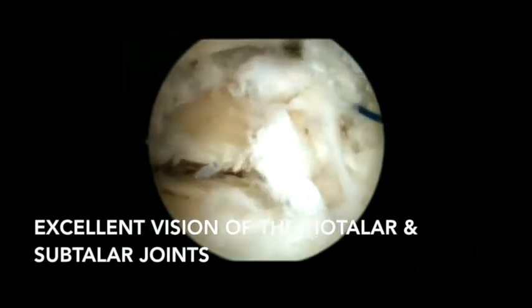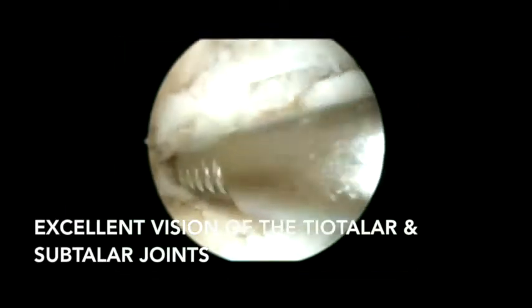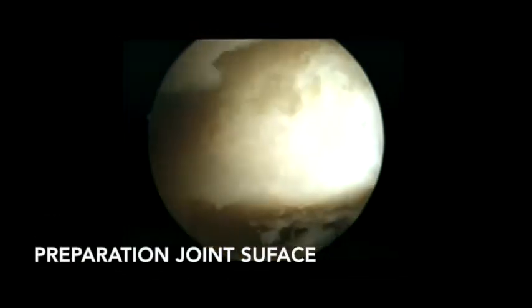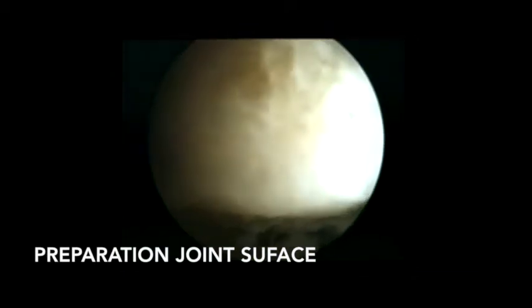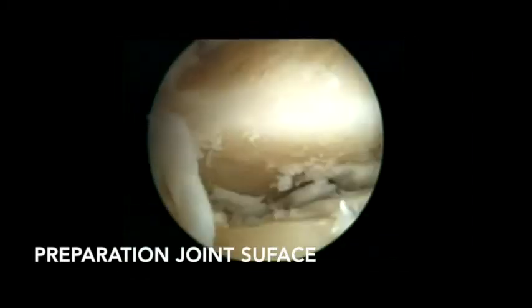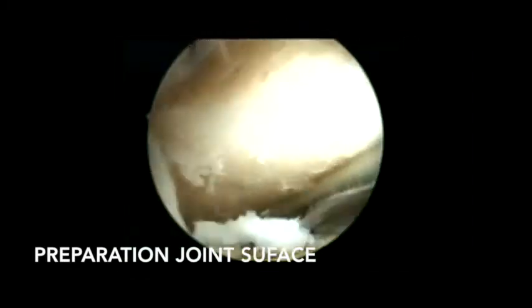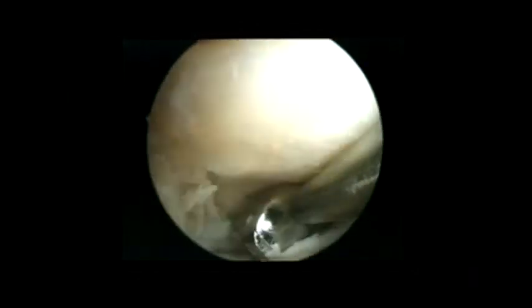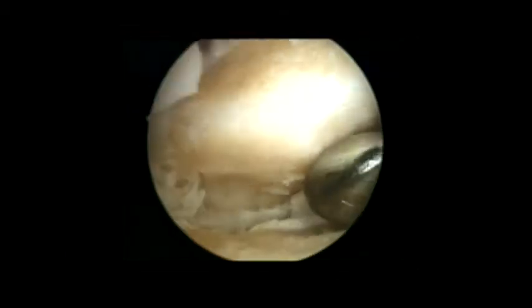The objective, as in all arthrodesis procedures, is to remove damaged cartilage, obtain healthy subchondral bone, and maintain parallelism of the articular surfaces, followed by rigid fixation. This step requires meticulous debridement of degenerated cartilage while preserving the highest possible amount of subchondral bone. We begin milling from posterior to anterior and medial to lateral to maintain the articular surfaces.